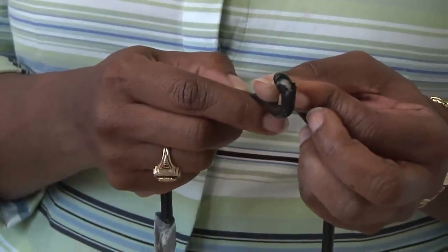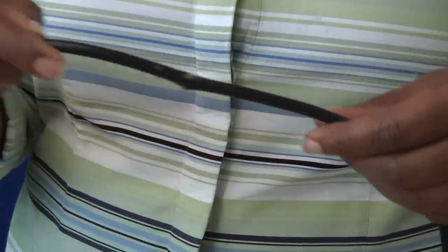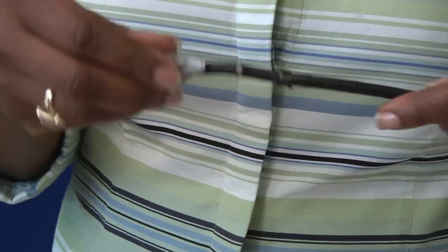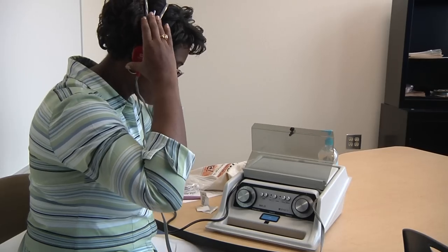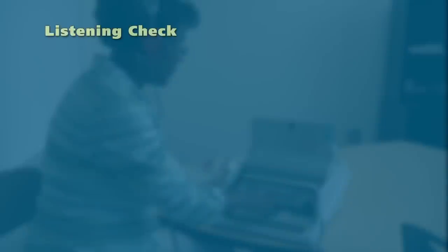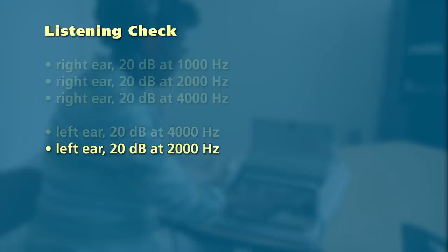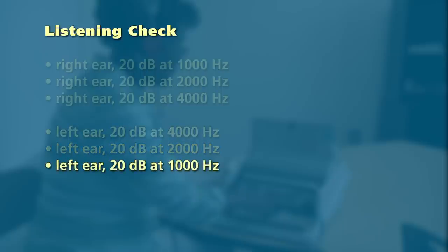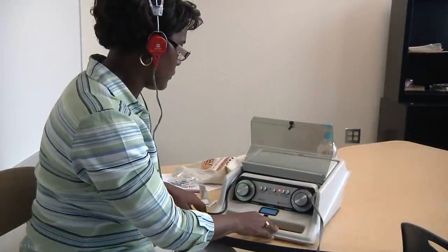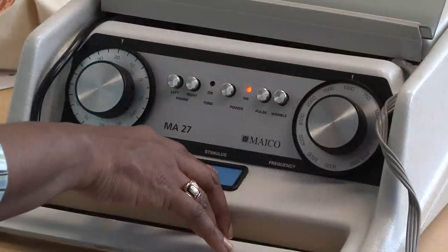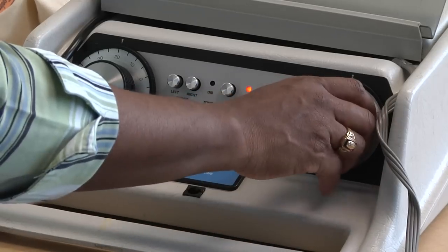Perform a listening and visual check every time the equipment is turned on. Inspect the cords and headset for any visible damage and be sure they are correctly connected to the audiometer; frayed cords should not be used. Put the headset on and check your own hearing at 20 dB at 1,000 Hz in the right ear, then check 2,000 Hz and 4,000 Hz, also at 20 dB. Then check the left ear, starting at 4,000 Hz, then 2,000 Hz, and finally 1,000 Hz, keeping the intensity level at 20 dB. If you have normal hearing and cannot hear all of the tones, either the equipment is not working or the background noise level is too high. Retest the equipment in a quieter room to determine if the problem is with the equipment or with the noise.